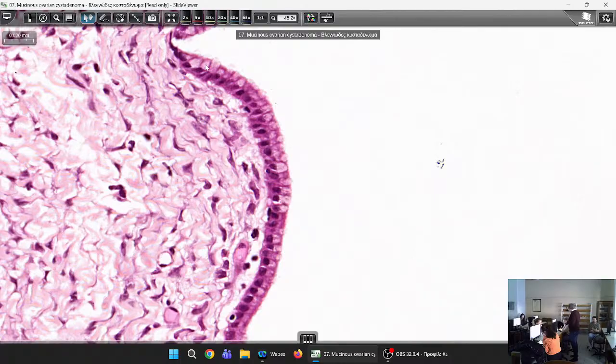When you have mucinous adenocarcinomas, they are more commonly unilateral, not bilateral, and they rarely spread outside the ovaries. So they rarely form mucinous or gelatinous ascites, rarely by primary mucinous carcinomas of the ovaries. So if you have this mucinous ascites, it is not likely that it has to do with a mucinous cystadenocarcinoma of the ovary. What is the much higher possibility?